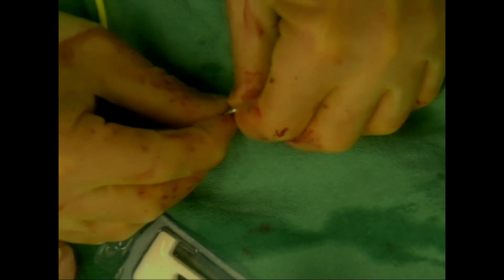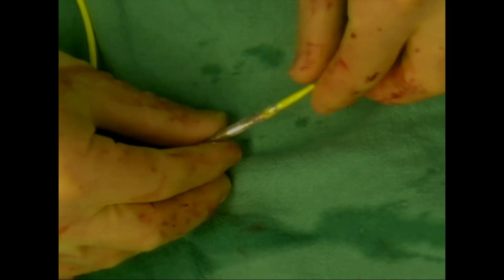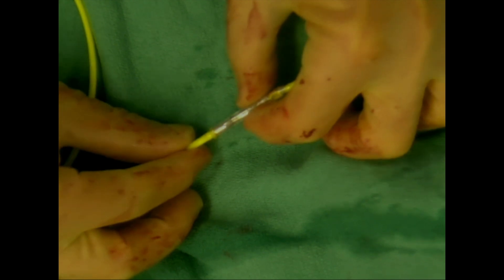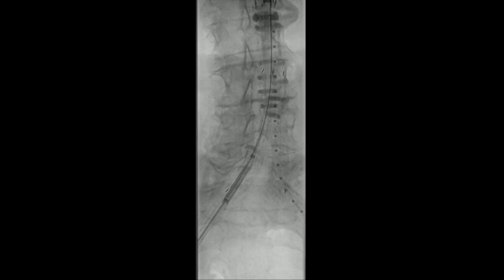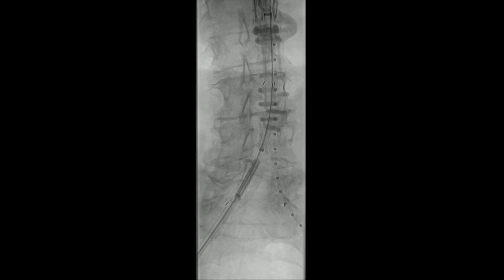Prior to mounting the balloon on the wire, it's important to ensure the sheath will be positioned above the proximal seal zone. After positioning the sheath above the proximal seal zone, the balloon and stent are loaded onto the wire and advanced under fluoroscopic guidance.